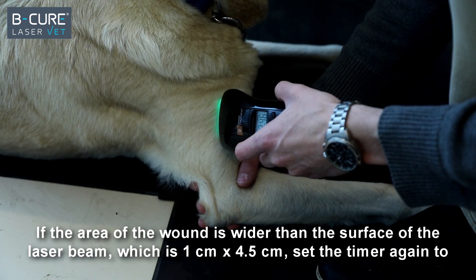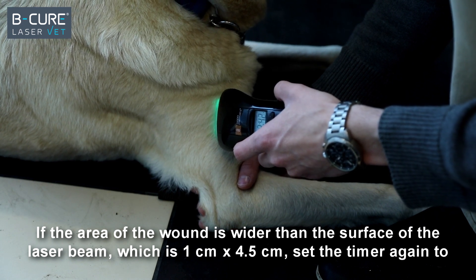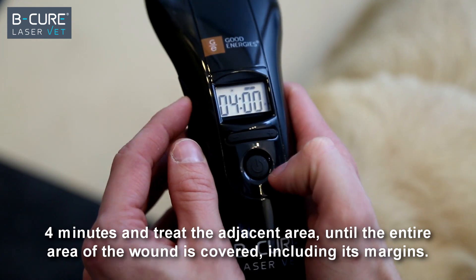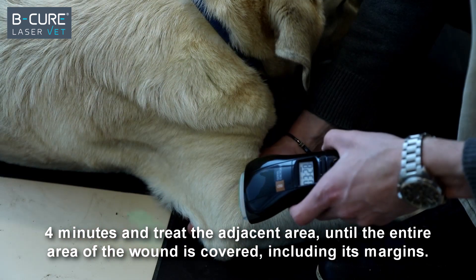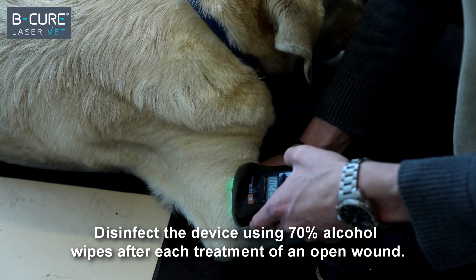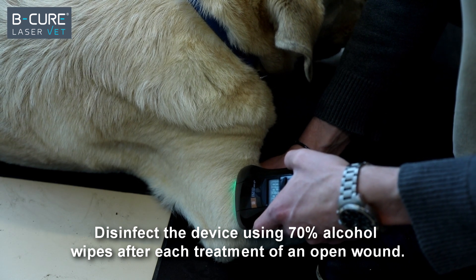If the area of the wound is wider than the surface of the laser beam, which is 1 by 4.5 centimeters, set the timer again to 4 minutes and treat the adjacent area until the entire area of the wound is covered, including its margins. Disinfect the device using 70% alcohol wipes after each treatment of an open wound.